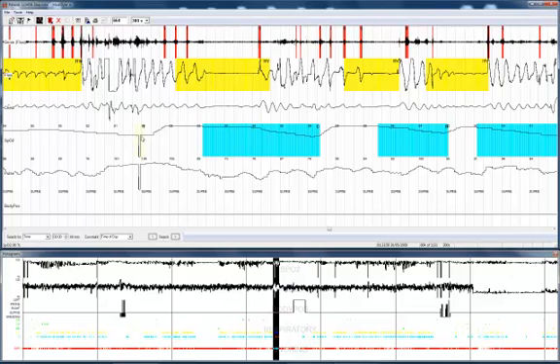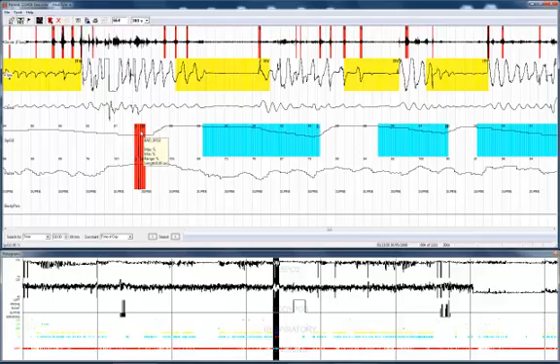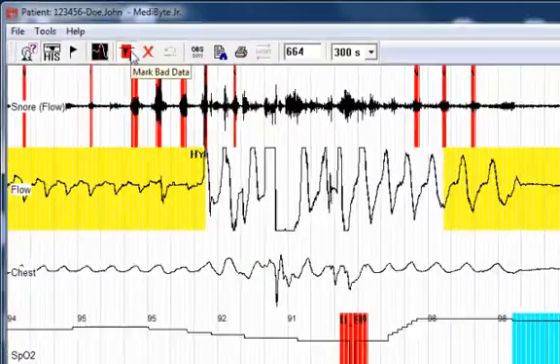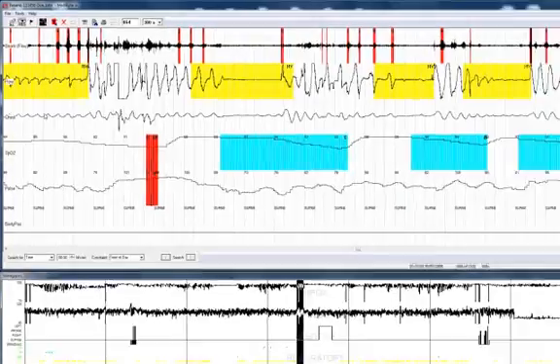The software will automatically mark bad data, but if you wish to change it, you can certainly edit it in much the same way you would edit any other event. Make sure you exit the mark bad data mode, otherwise you won't be able to enter events later.